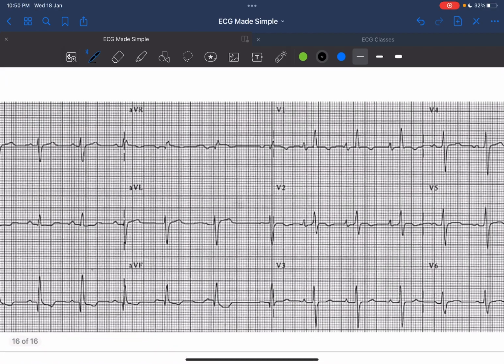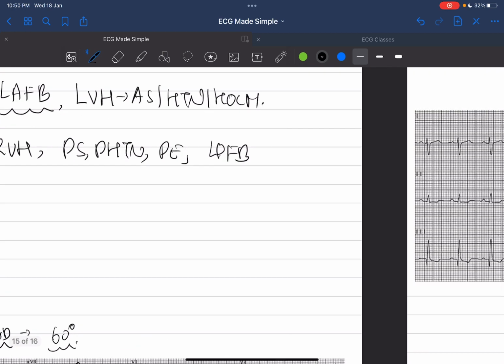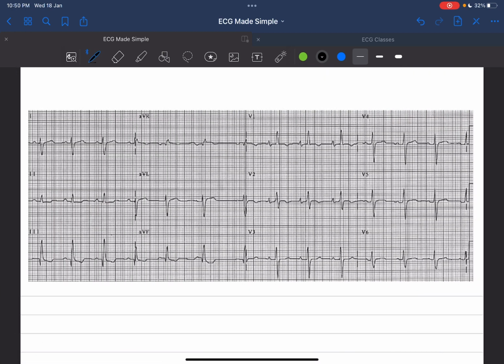Then second, you look at this ECG. Again, pause the video and try to answer this. Okay. Now I say first step 1, look at lead 1, lead 2 and AVF. I am pretty sure that leads 1, 2 and AVF do not have the highest QRS complex. It is lead 3. Lead 3 has the highest QRS complex. So my step 1 is negative.